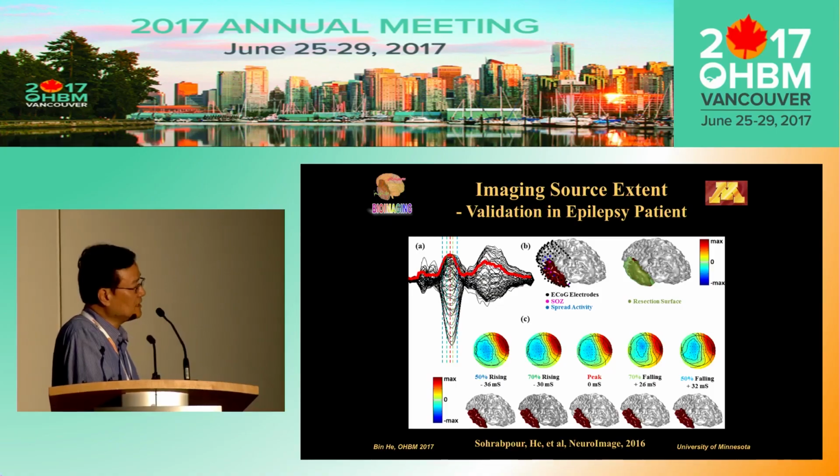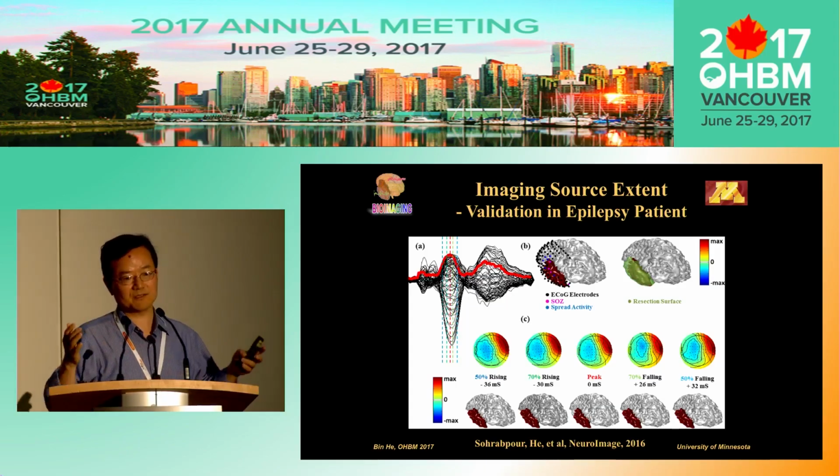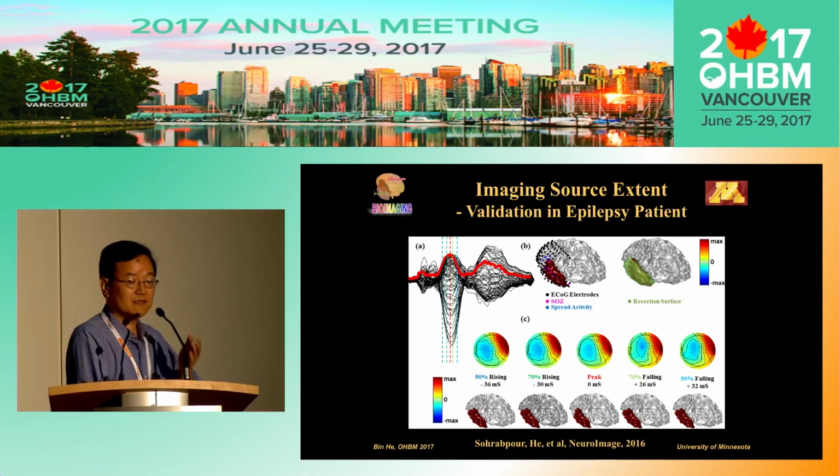Here is an inpatient. We're testing epileptic patients once again. Here is our inverse solution, and these are ECoG recordings. These are the seizure onset zones identified. This is the resection, and we found that these agree as well. So while we are still trying to test a much larger number of patients, our initial experimental result and the systematic simulation result suggest that EEG or MEG can be used to objectively estimate not just where the source originates, but also the extent.